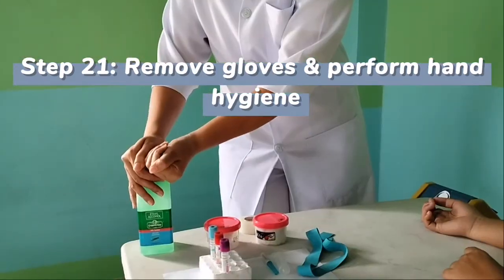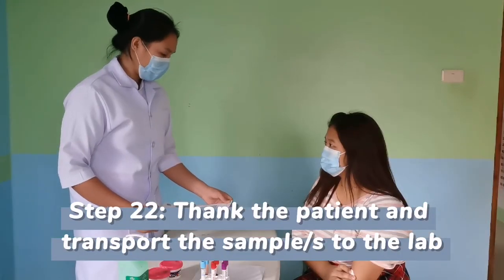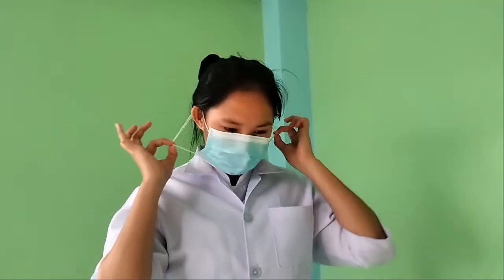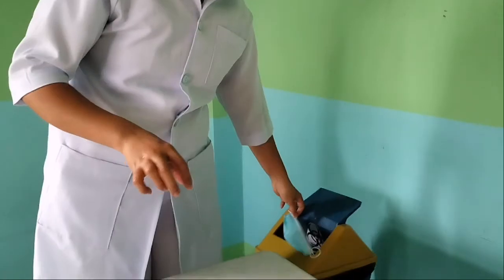Dispose of your gloves and perform hand hygiene. After the procedure, thank the patient and transport the samples to the lab. And you're done!